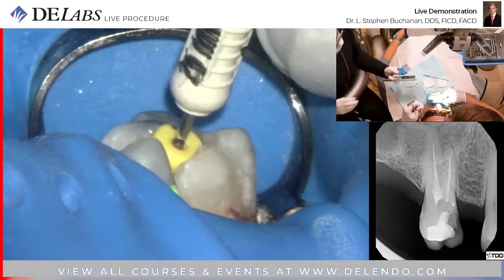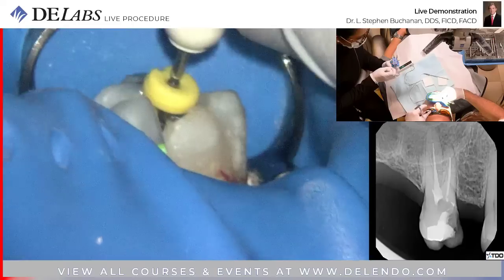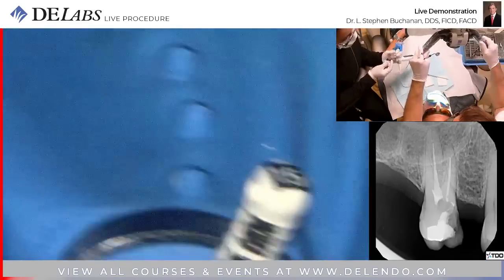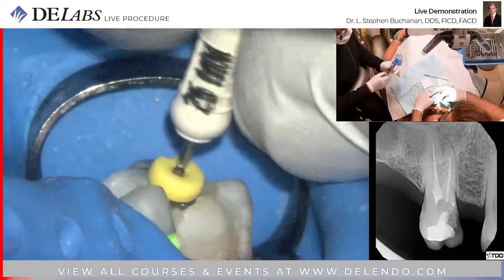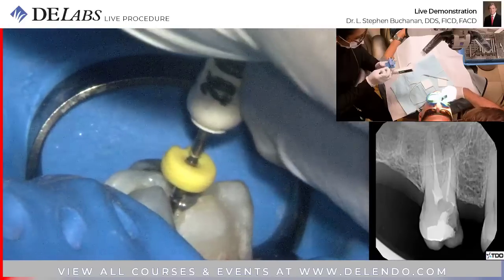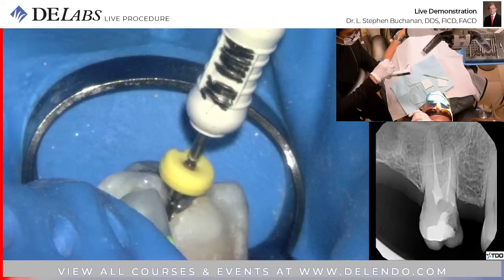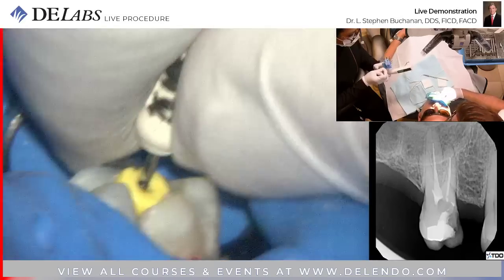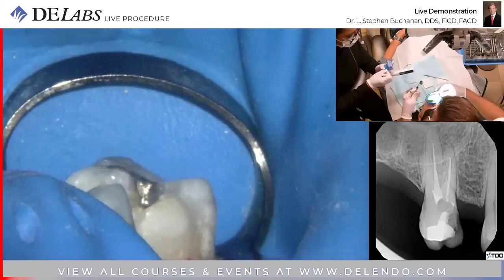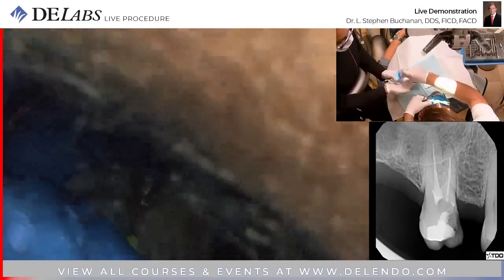I'm gauging, I'm only pushing straight in. If you have a perfectly shaped canal and you put a file there that is binding, absolutely correct, and that's the terminal shape that you should have. I'm going to pull back so I don't goof this, but if you are there and you just go once like that, you've cut it bigger. So you can only use these, they have blades on them. Push them straight in. You can push them as hard as you want. Push them straight in, we can make this head move, but no wiggling, no rotation. Now, here comes a 20. It goes through. 30.